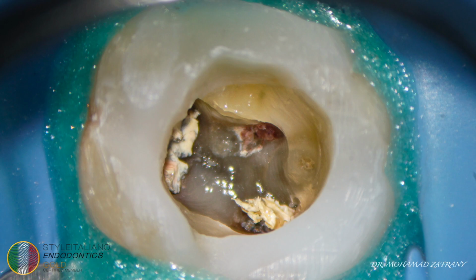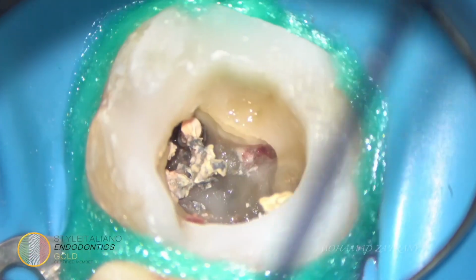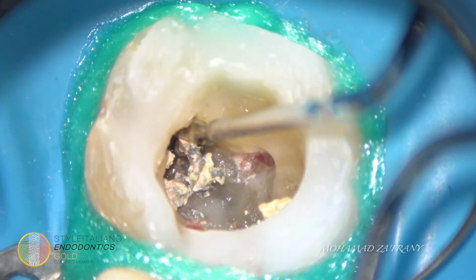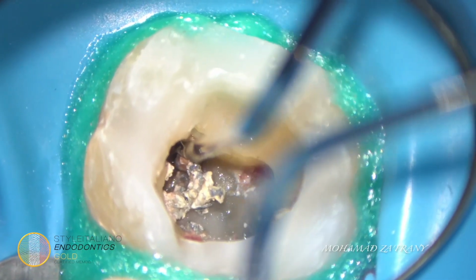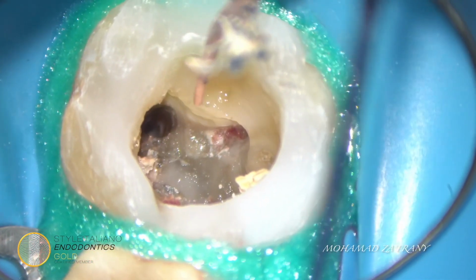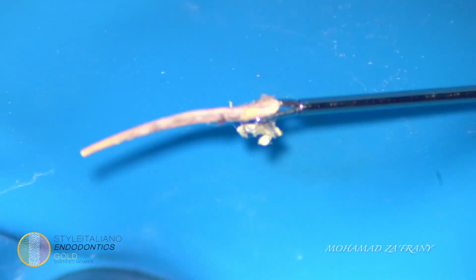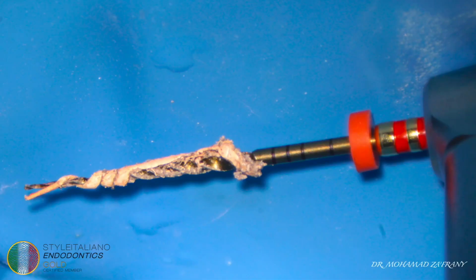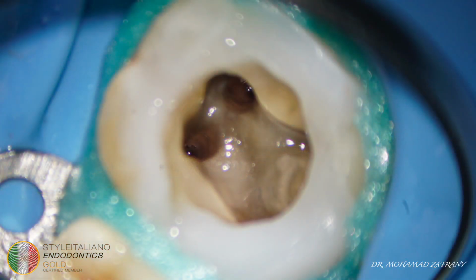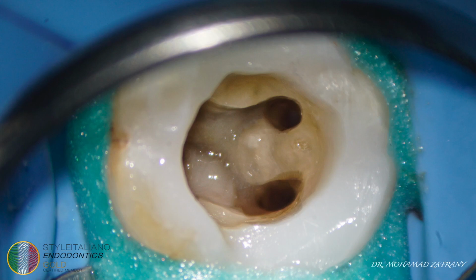this molar. Here I started to remove single cones using a micro tweezer to avoid cutting them by rotaries and leaving remnants in the root canal system. Some gutta-percha cones were removed as one unit by rotaries, and this is the cleaned buccal canals, and here are the palatal canals also cleaned.